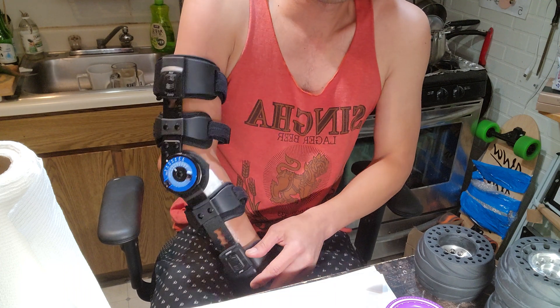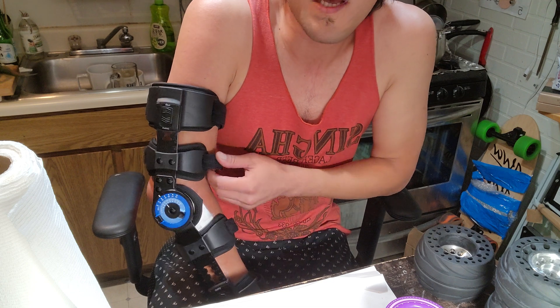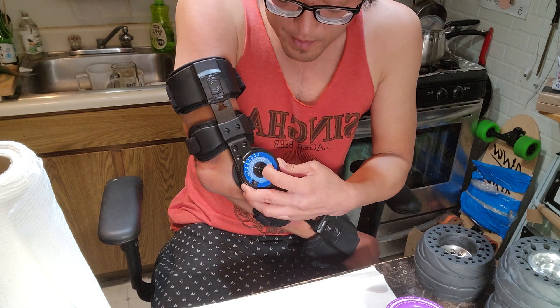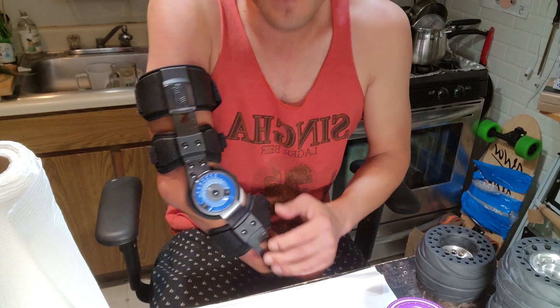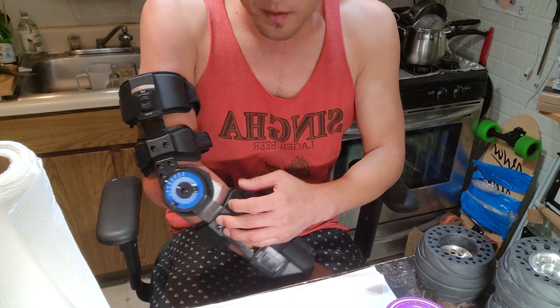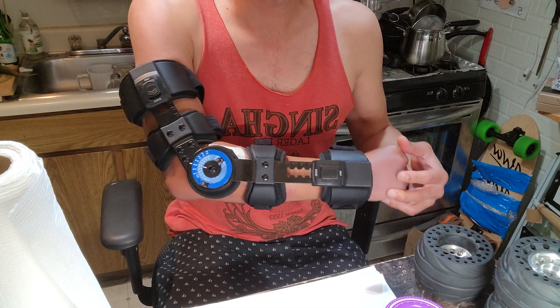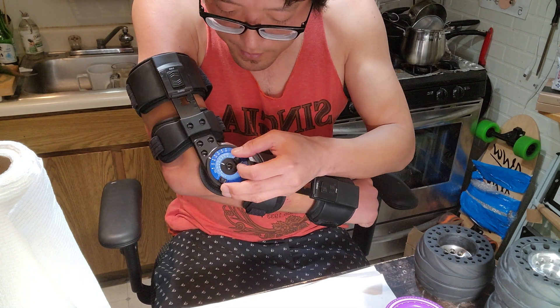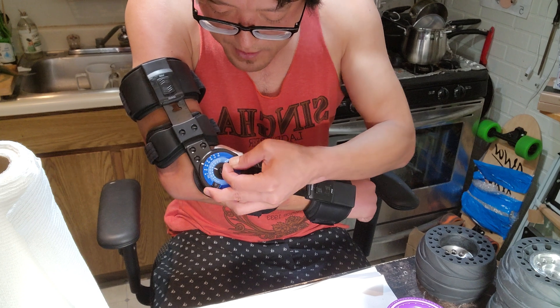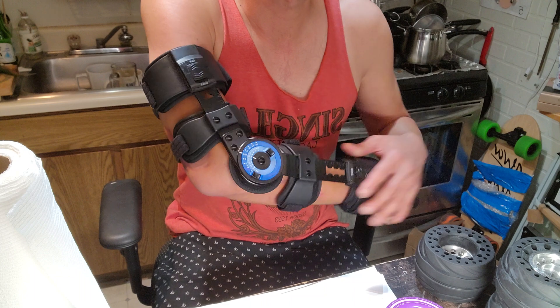So I bought this thing called an elbow immobilizer with ROM — ROM stands for Range of Motion. I have it locked right now at 30 degrees because this way it will help fuse my bones. As I get better I can increase the range. Right now I have it set so I can move from 30 degrees to 60 degrees.